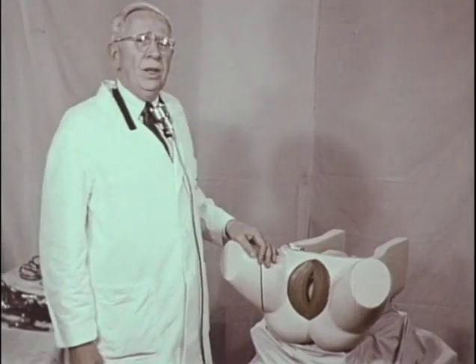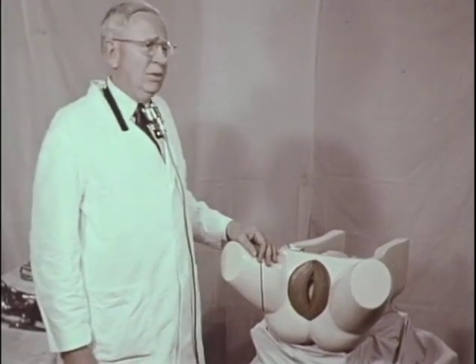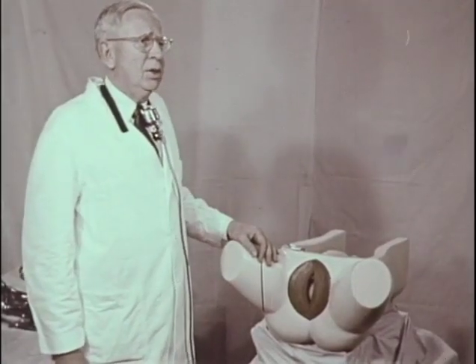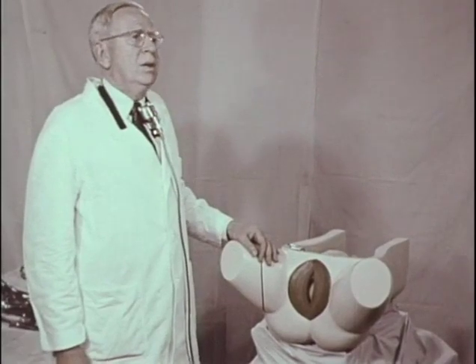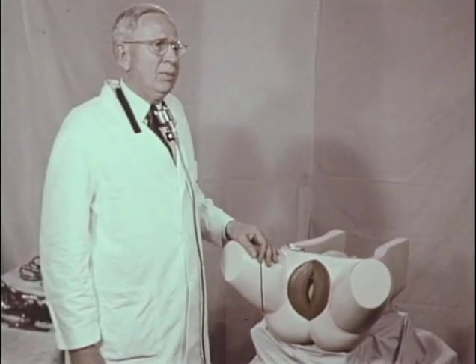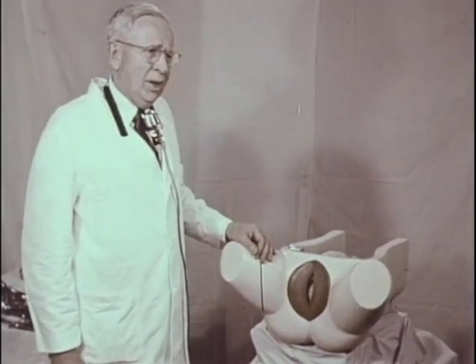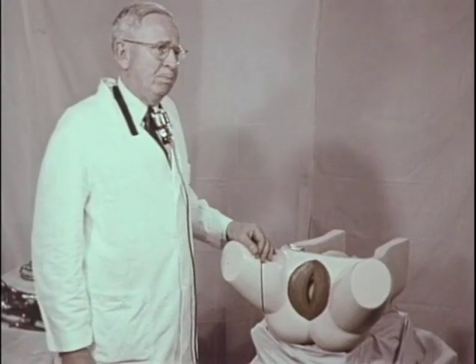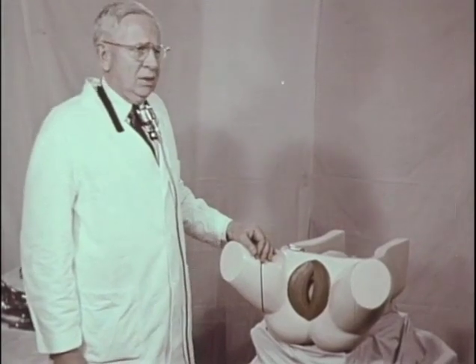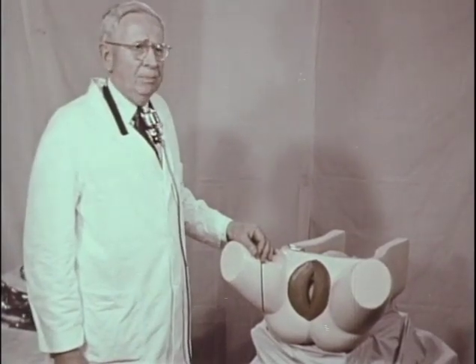Second, we have instrumental rotation of the occiput transverse to anterior. This is done with an Elliott type of forceps because the overlapping shanks and the short round cephalic curve of the instrument take up less space and meet fewer points of obstruction during the wandering maneuver of application of the anterior blade. Then we have the instrumental rotation by the special forceps, the Barton and Kielland. These will be taken up at a later time.